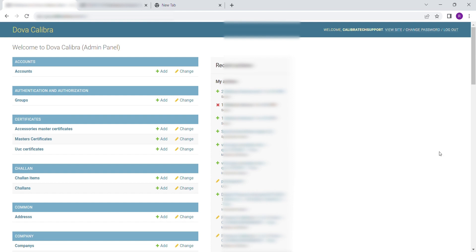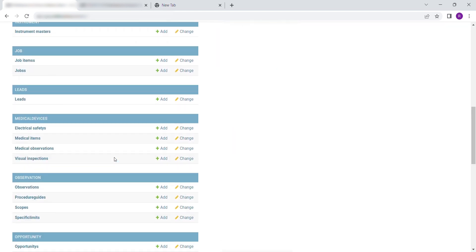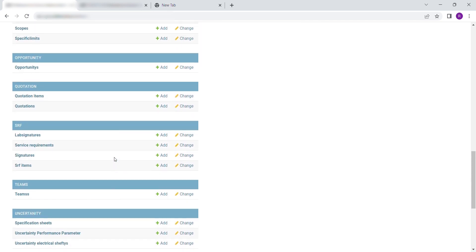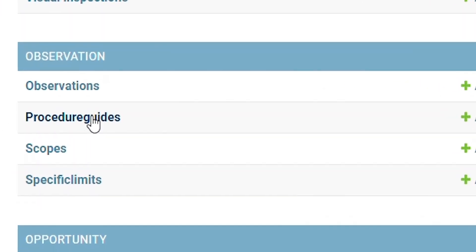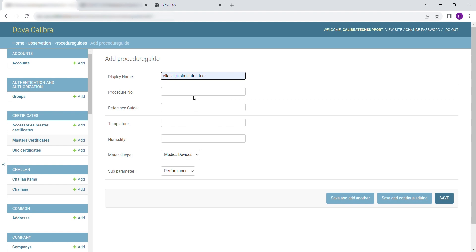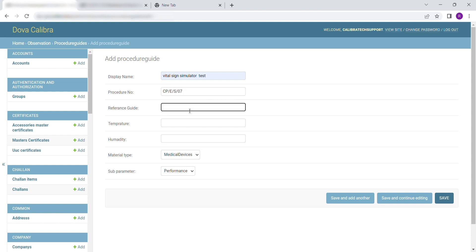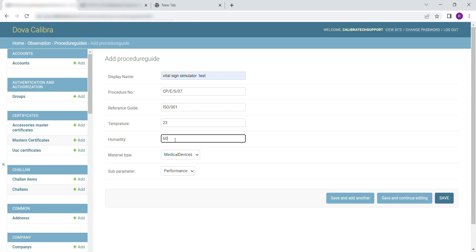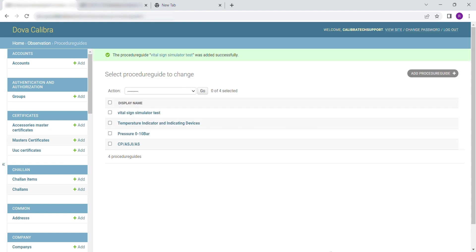To enter procedures, scroll down to Observation. Select Procedure Guides. Then click on Add Procedure Guide. Fill in the following details: enter the display name, enter the procedure number, enter the reference guide as specified in the procedure guidelines for calibration, and enter the temperature. After filling in the details, click on Save to save and exit, or Save and Add Another to continue entering procedures.